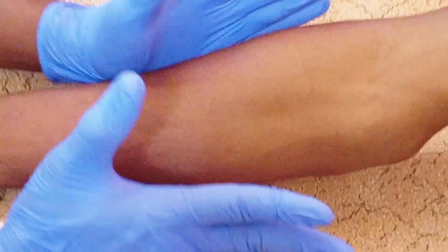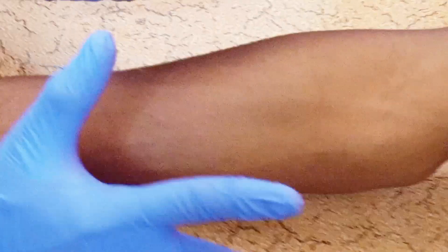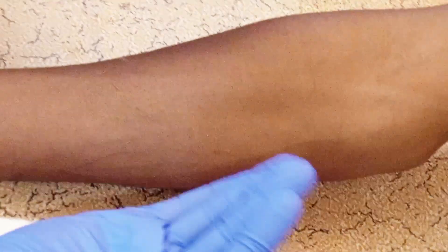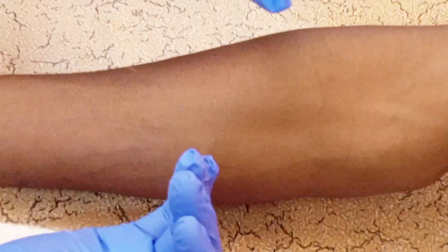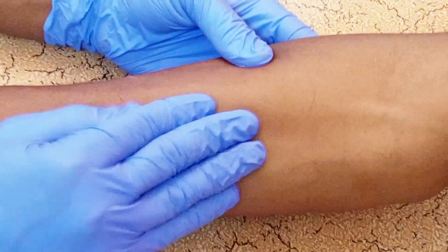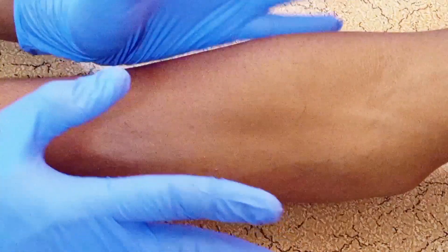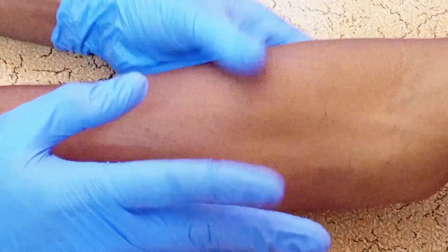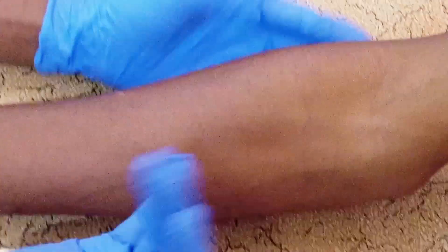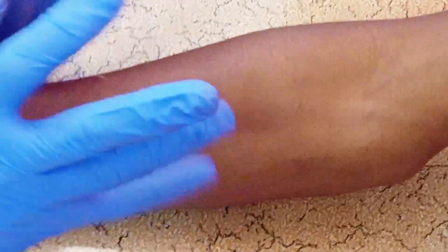Hi everyone, welcome back. In today's video, we shall be discussing how to take a blood sample, that is phlebotomy, by using the butterfly method. So how do we find a vein?